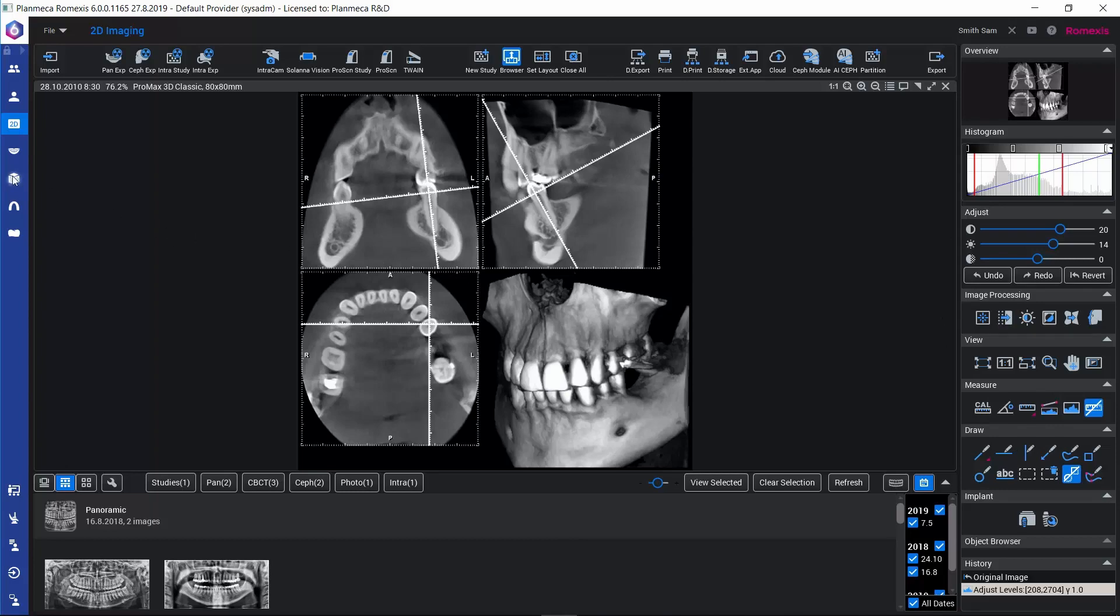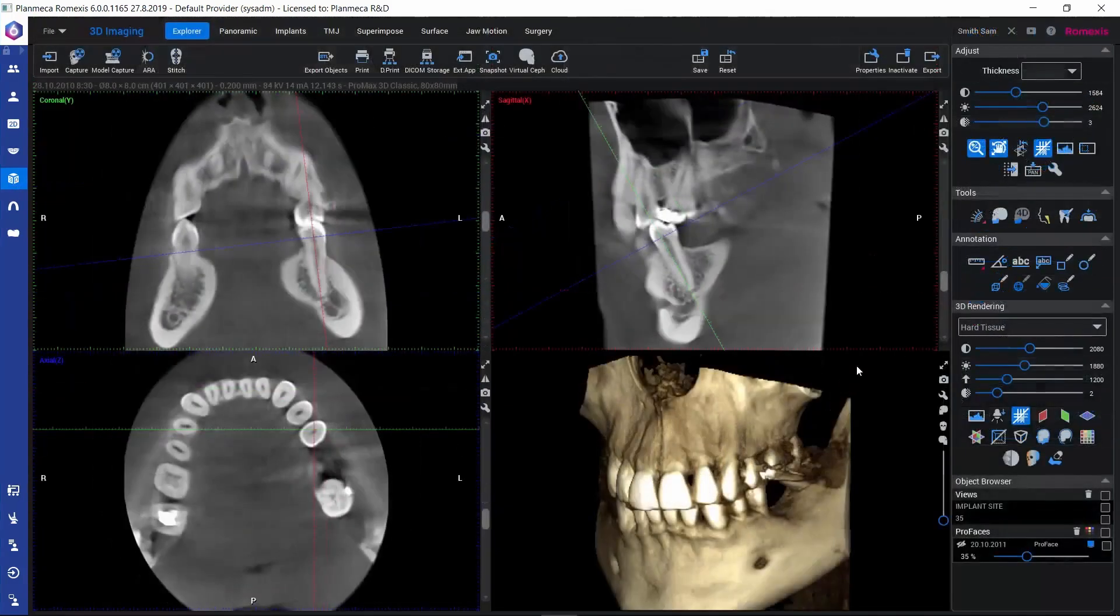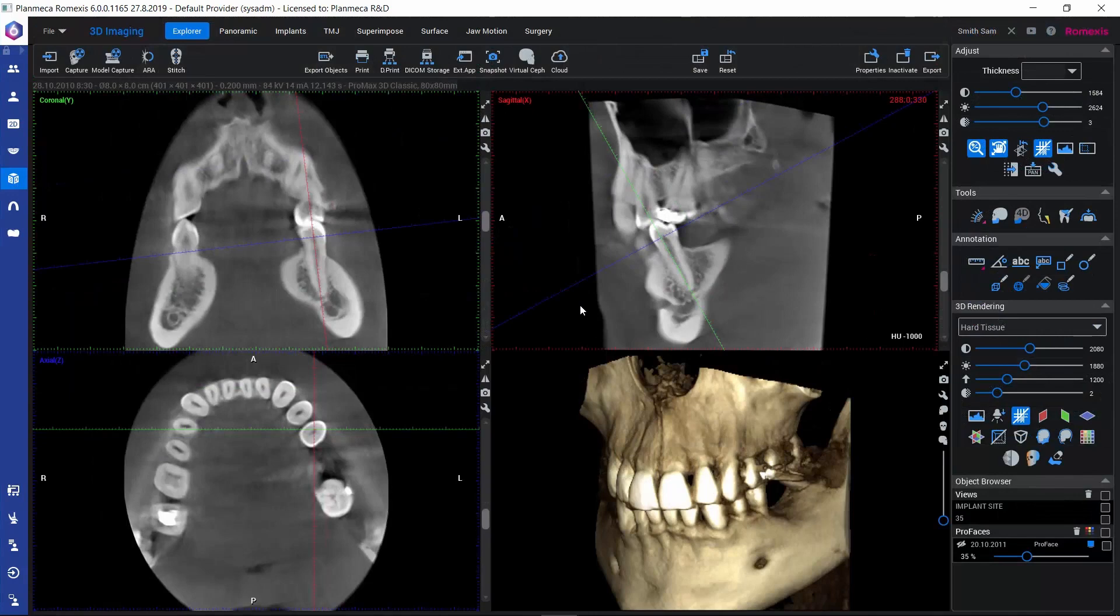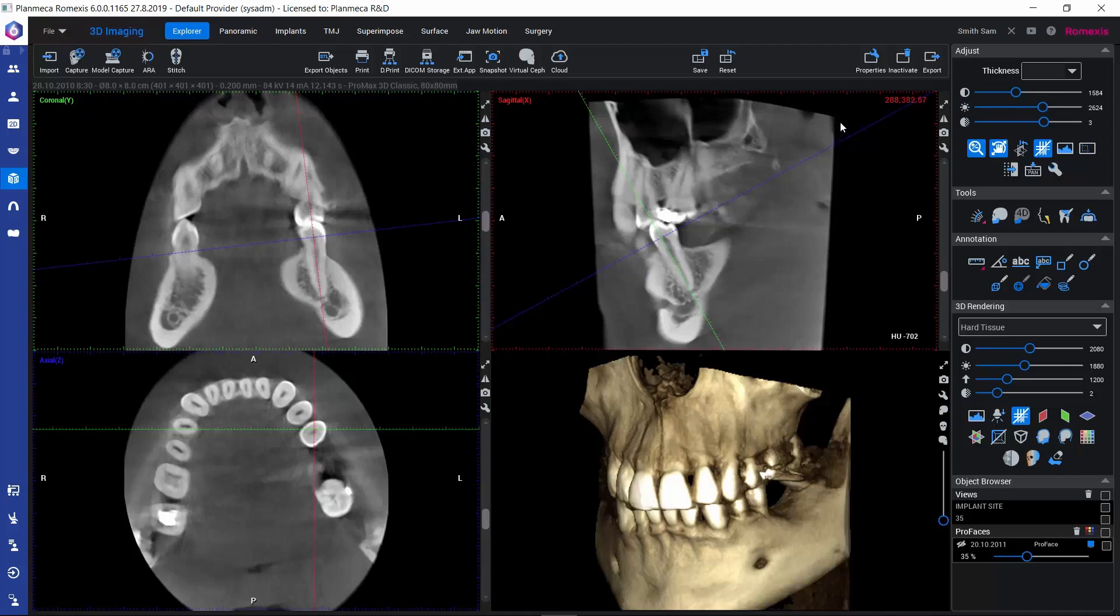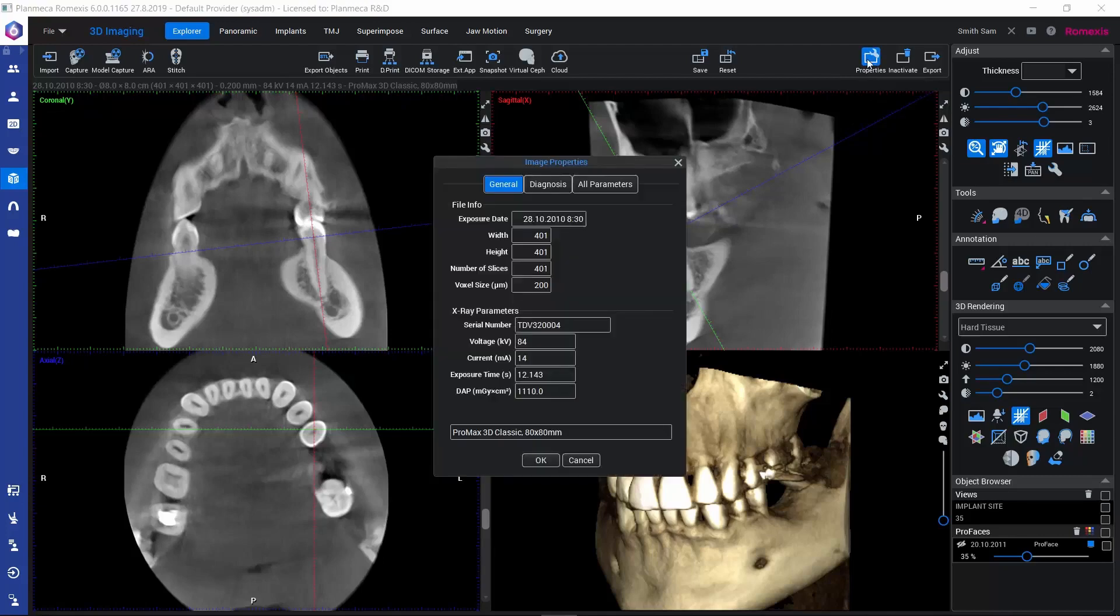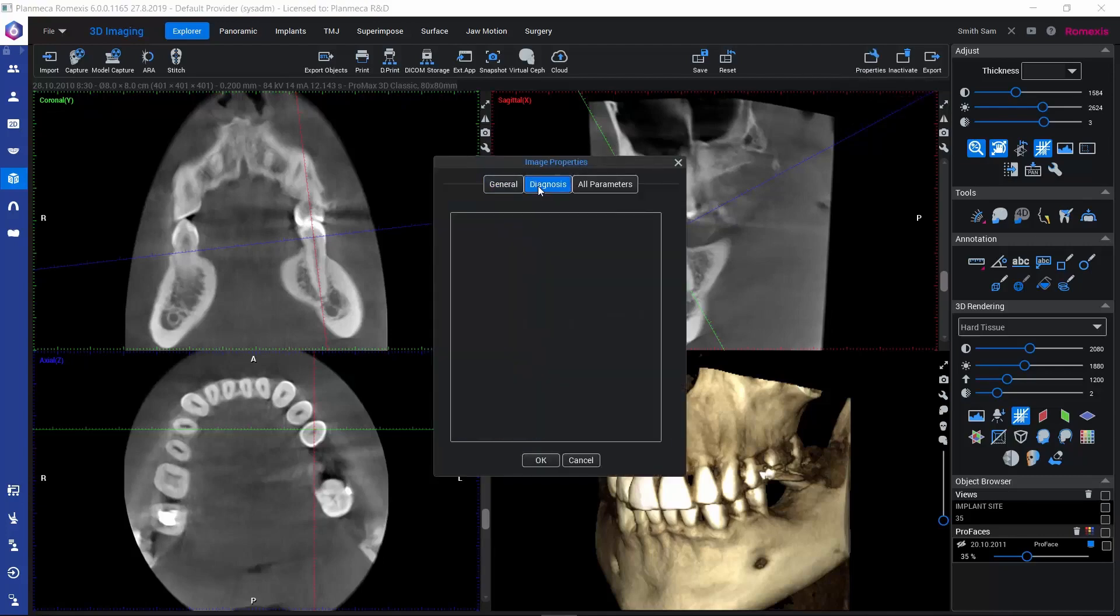Let's go back to the 3D module. Finally, let's take a look at how we can write diagnosis for the volume. Diagnosis can be found here in the Image Properties in the upper toolbar. If we open this, we can find the Diagnosis tab where we can write our diagnosis for the image so that we can view it later.